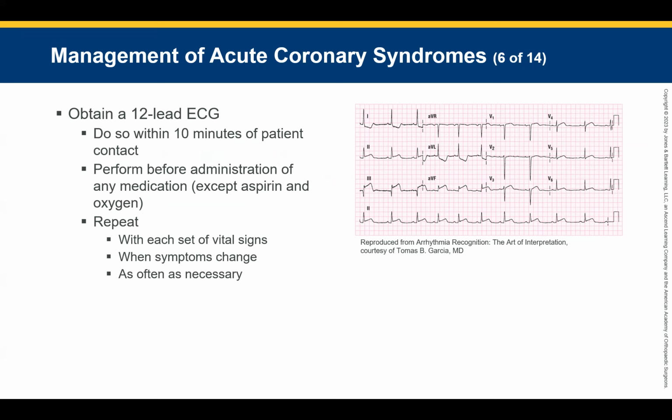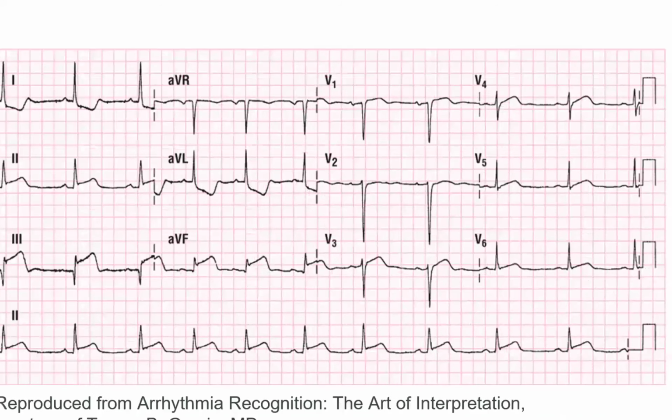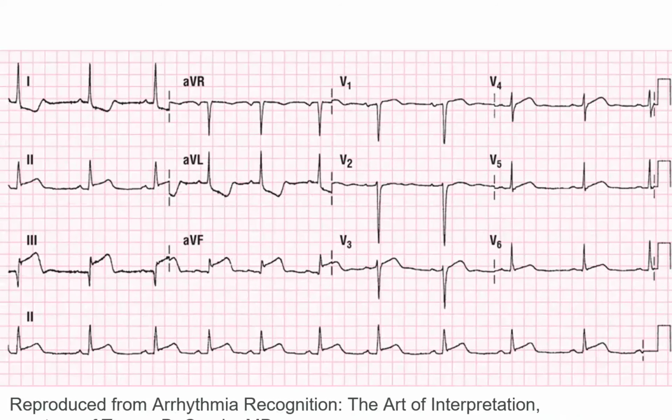Do we have P waves? Yes. P waves are regular? QRS narrow. Our rhythm is actually not regular. It gets wide, it slows down. So we are actually in a sinus arrhythmia. It looks like we had a rate change. Going to V1, wide or narrow? Narrow, so no bundle branch.